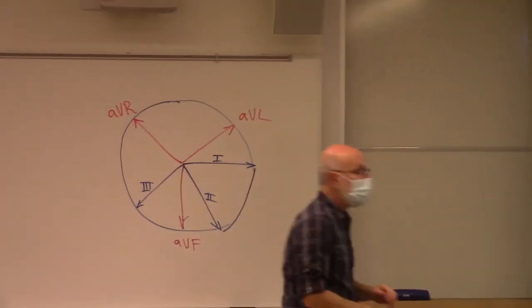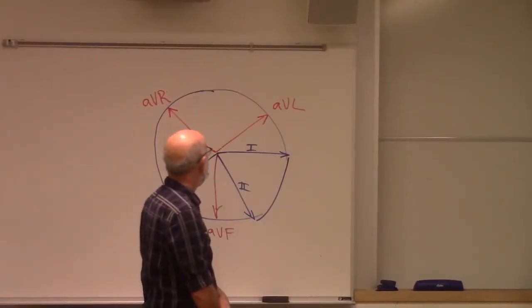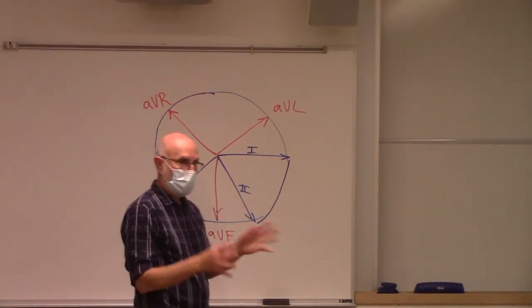Would this signal be positive in lead 2? Yes. Would this signal be positive in lead AVR? No. You're getting the hang of this.